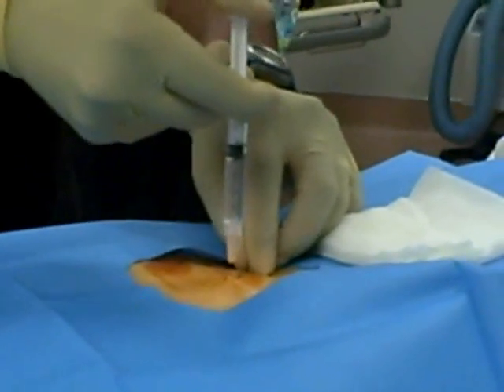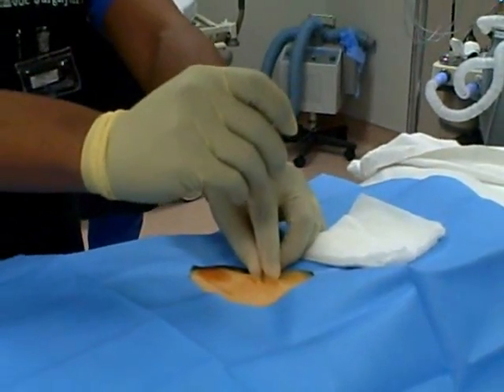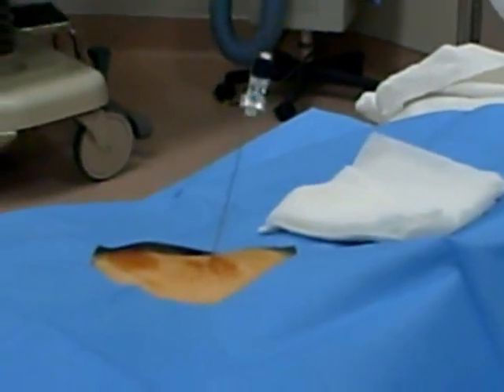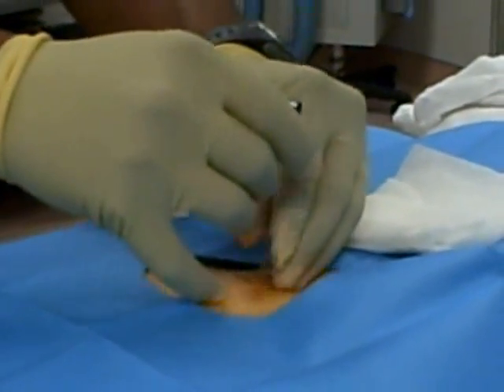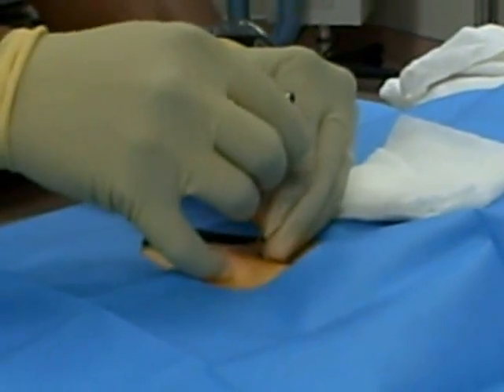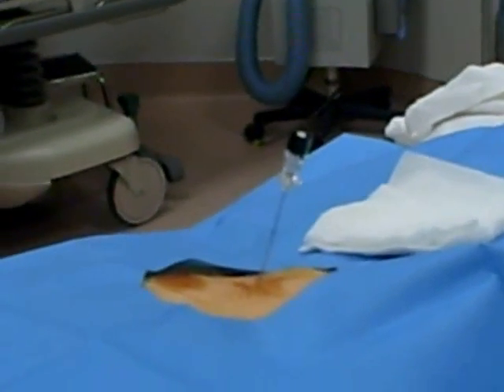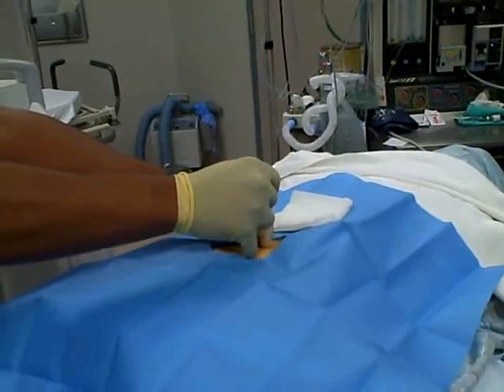Then we numb the skin overlying that target with the local anesthetic, small pinch and a burn, really not painful at all. Next, we insert the spinal needle just under the skin, and then we use the X-ray or fluoroscopy machine to guide the needle under direct visualization to a very precise target and point for injection. We'll usually adjust the angle and the view of the fluoroscopy machine so that we can triangulate and identify a spot or target for injection in three dimensions.